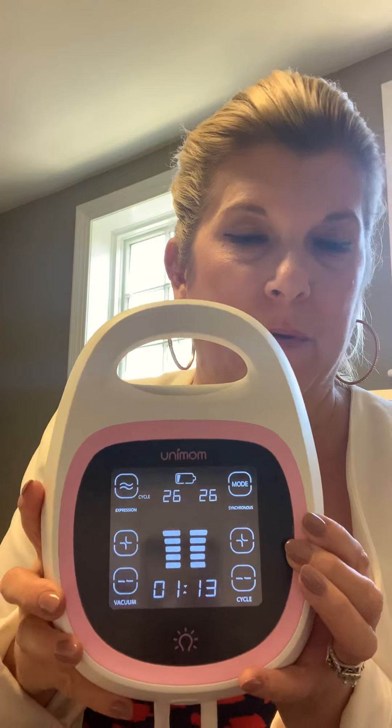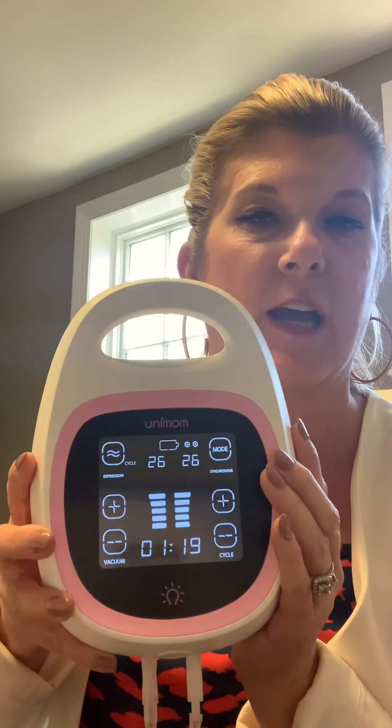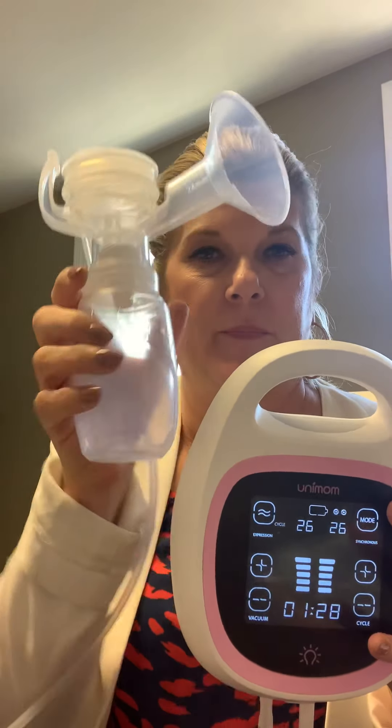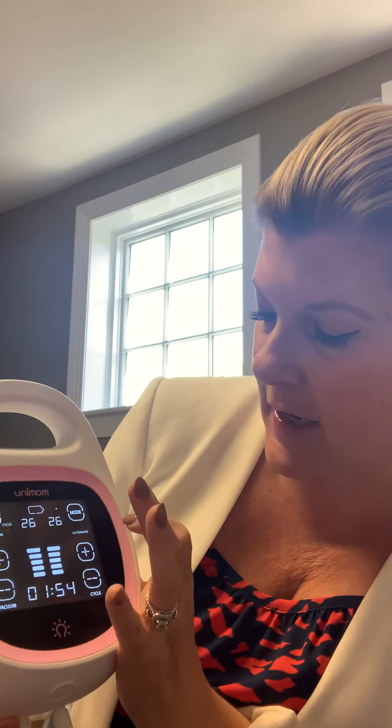What's unique about this pump — and we've seen every pump on the market — no other pump does this: you have the ability to toggle between modes and control both sides of the pump. This is your flange, tubing, and bottle, and it comes with two. You can set both sides right and left to the same setting, or if one side produces more milk than the other, you can adjust that one side to not be as strong or cycle as fast. You can really customize the settings of this pump.